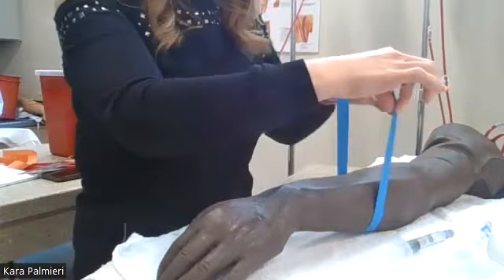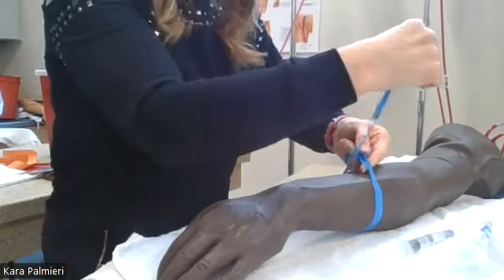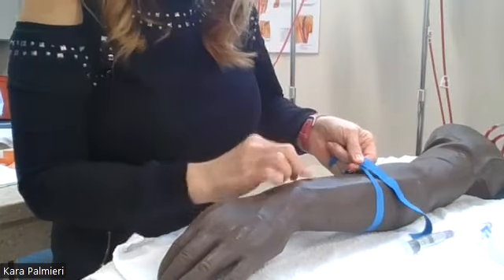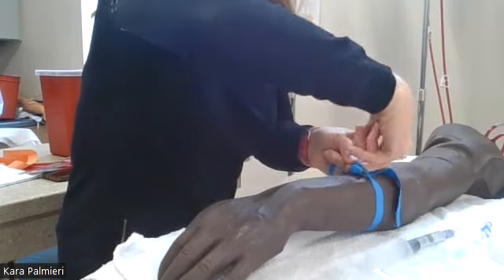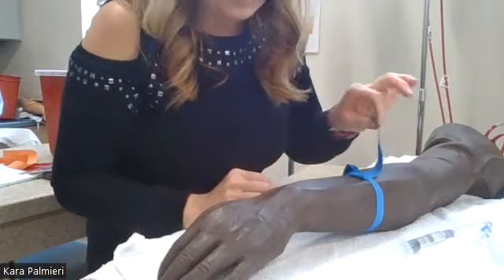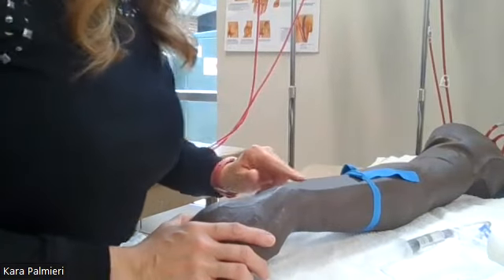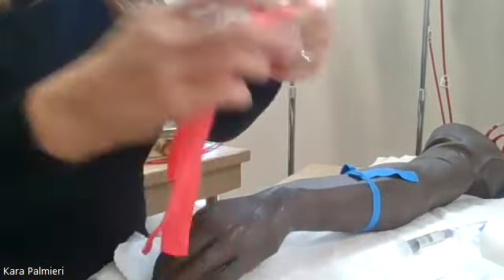So I'm going to put this under here, and I'm going to pull both sides up kind of tight like this. And I have a finger under here. That's to minimize how much hair pulling I'm doing. So I have this crisscross with my finger underneath, and I'm just going to reach here and tuck that edge right there. Okay. And then when I want to let go of it, I can pull this tab and it'll pop right off really fast. So I'm happy with what I see here. I'm going to go with this vein right here. So let me get my gloves on.